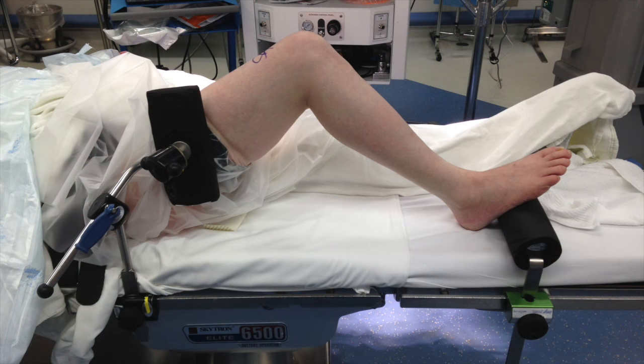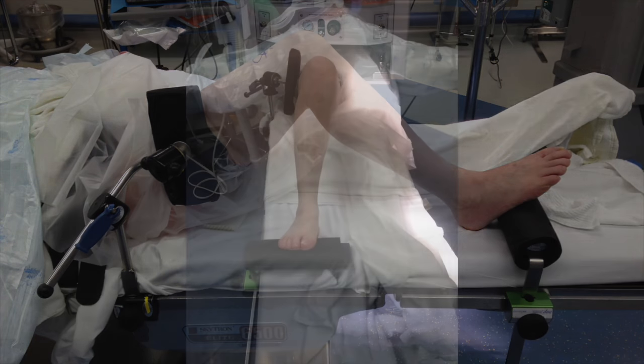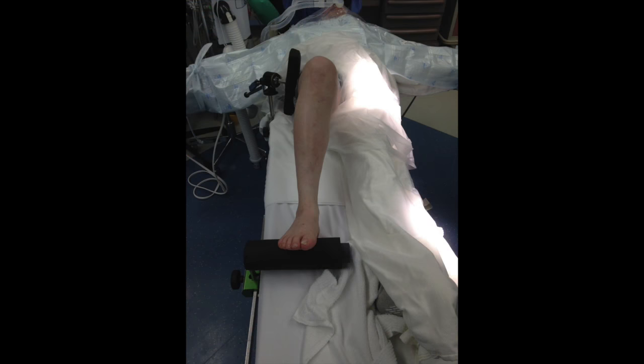The post is placed slightly higher than the bed, positioned to allow for a valgus stress to be applied when working in the medial compartment. This placement is purposeful, as it allows for an additional working area since the thigh cannot escape under the post.